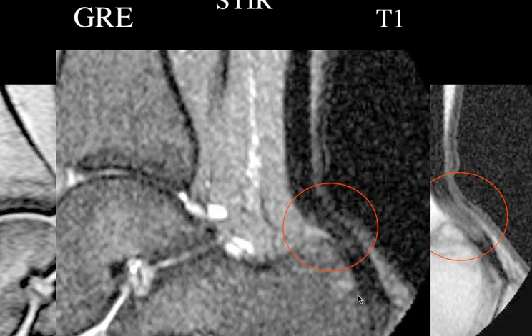What's STIR here, right? Or STIR now? I'm sorry, STIR. Yeah, STIR with the longer TE. That's right. So the modern T2 weighted images still are susceptible to magic angle. Yeah, it depends on what the TE is. Modern T2 weighted images that we'll get to later, if the TE is long, then you won't see much magic angle effect. This is the effect that you predominantly see on short TE images.